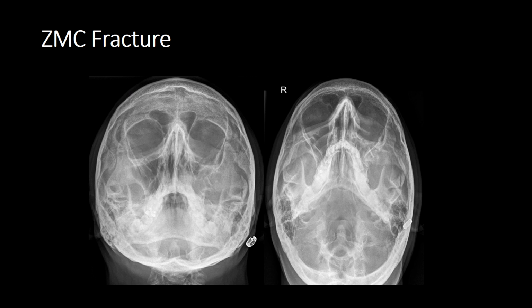Let's just have a quick look. Yeah, that's fine. Nice bit of the peg. Quick look at that. That's fine. Okay. Please take off artefacts, particularly in facial bones, as well as dentures. That would be really helpful.